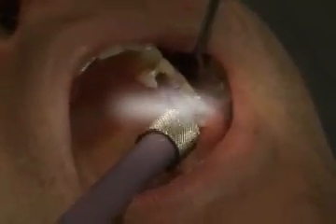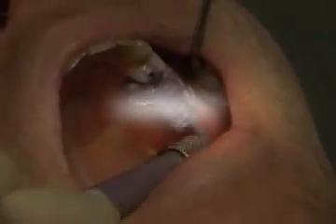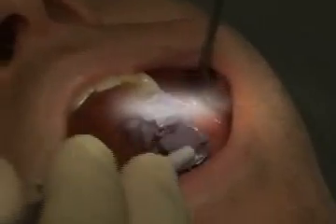One of the most common mistakes when a dental office takes an impression is the presence of air bubbles. By using a fine syringe, as seen here, most air bubbles can be avoided. Distributing the impression material with the aid of the air blower further decreases the presence of air bubbles.